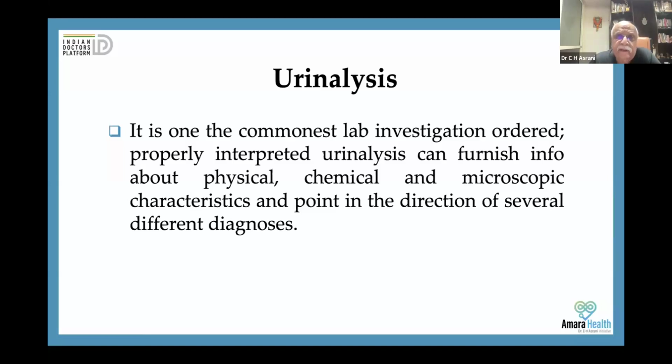If properly interpreted, if you look at every variable of the report, it can give you tremendous information about physical, chemical, and microscopic characteristics. And since urine is a product of kidney, it gives you information about the kidney and many times about the body system also.